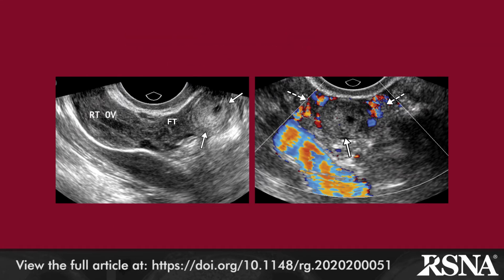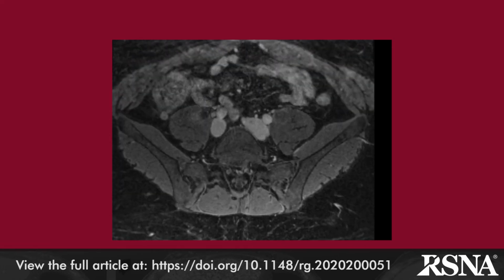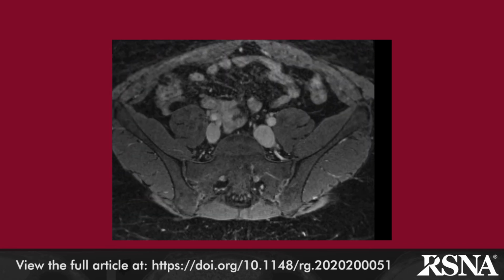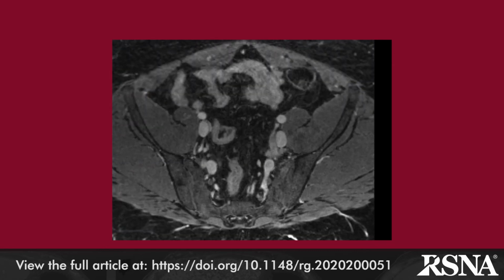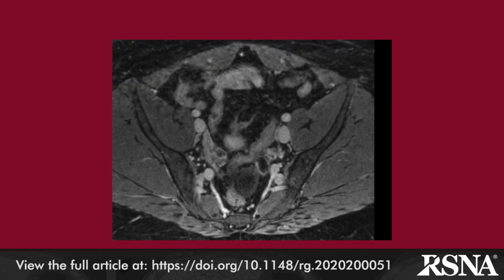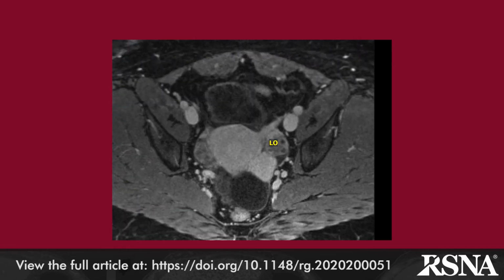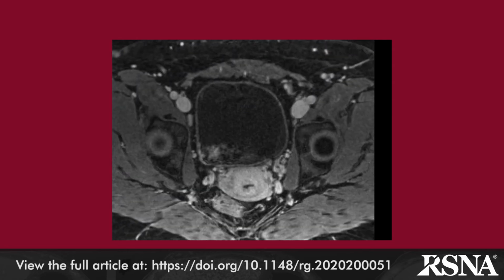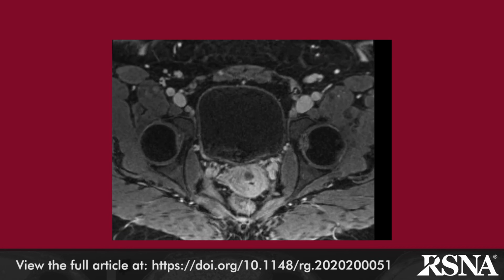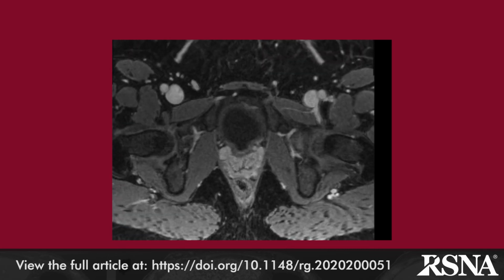Isolated fallopian tube torsion is a rare cause of acute lower abdominal or pelvic pain and can mimic other more common conditions. On cross-sectional imaging, a torsed fallopian tube may demonstrate the following features: thickening of the fallopian tube wall, hyperemia or absence of flow indicating necrosis within the wall, hydrosalpinx or hematosalpinx within the torsed portion of the tube, a beak similar to sigmoid volvulus or the whirlpool sign, the presence of mucosal folds or septa within the cystic adnexal structures, representing a dilated fallopian tube, and finally a normal location and appearance of the ipsilateral ovary.